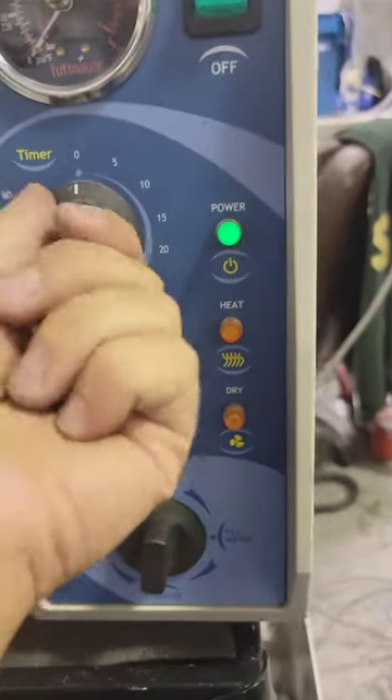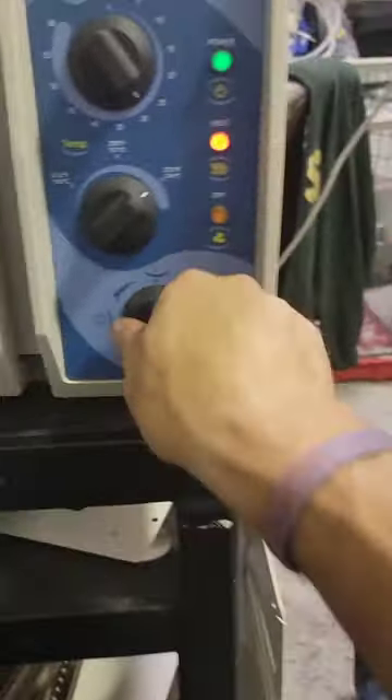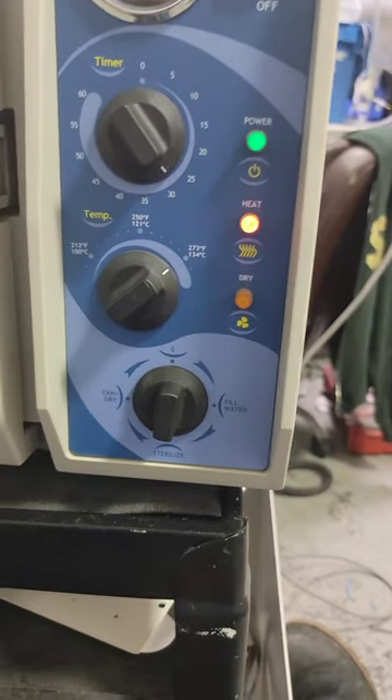Now, in order to heat up, we need a timer. I don't know exactly how long it's going to take, so just set it to 30. Heat. Technically, you can walk away for about 10 minutes — it's going to take a while to heat up. We're on a cold start; from a hot start, it's going to heat up quicker.